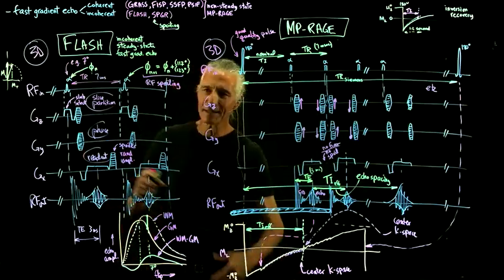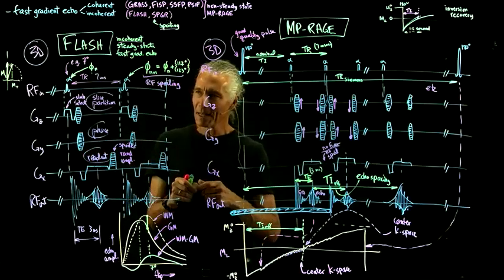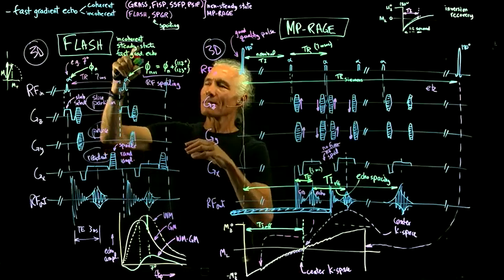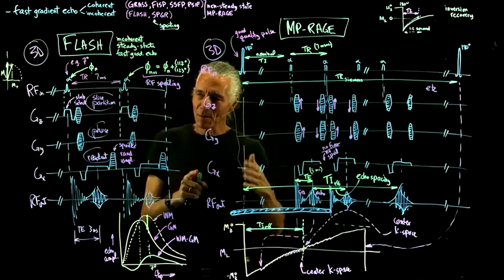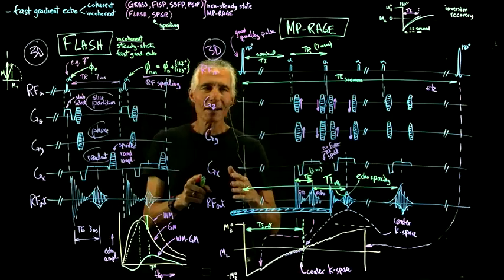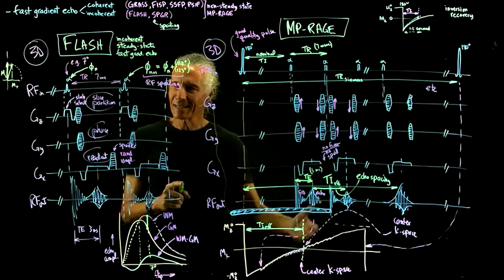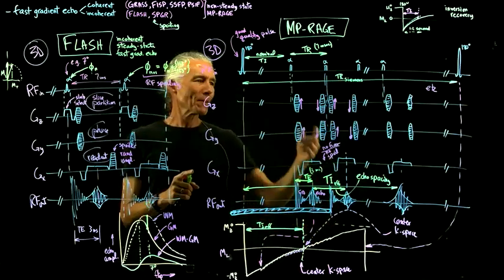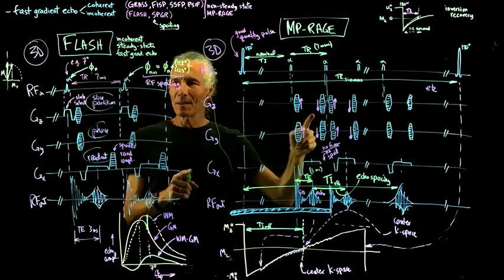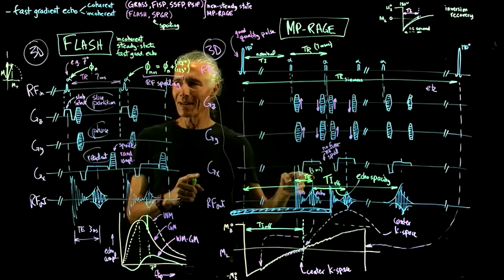They started off as the slow gradient echo, which is very straightforward. And then we do this sort of steady state where we do a bunch of ones where we can either spoil or not spoil. And then let's tack in an inversion pulse in this non-steady state thing. And then for the heck of it, let's spoil the magnetization in the phase-encode directions, but not in the readout direction.